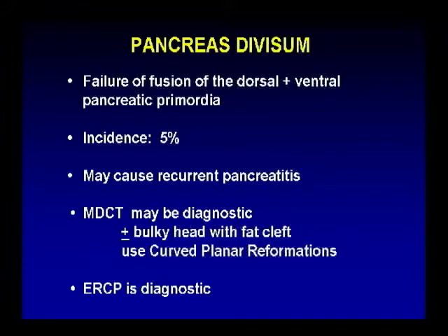Now, multi-detector CT may be diagnostic if you're able to see a fat cleft within an enlarged head. That's often a clue that you have pancreas divisum. Or if you use these curved planar reformations, you can actually trace out the duct of Wirsung and the duct of Santorini. ERCP is the gold standard.